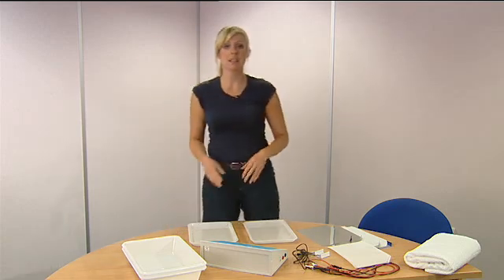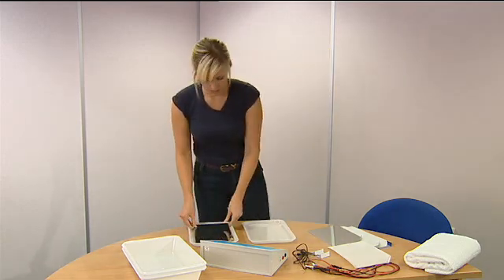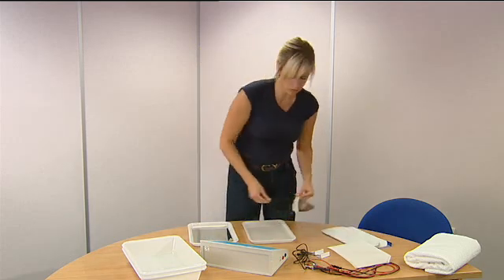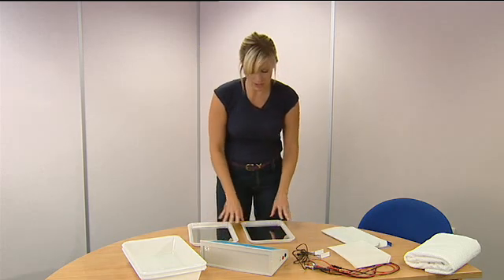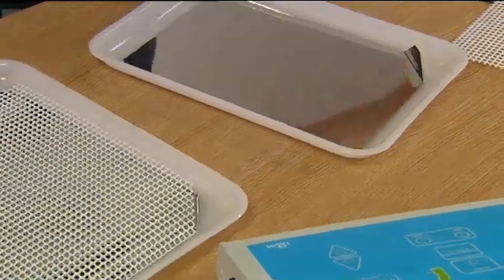I'm now going to show you how to treat the hands only. Place the electrodes into the small baths, ensuring that the upturned corner of the electrodes is in the upper left quadrant. Then place the acrylic grills on top of these.